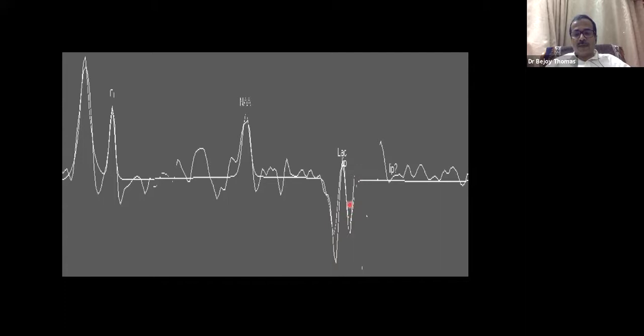For example, this is the 1.1 ppm 1,2-propanediol, which is actually there because you are loading with phenobarbital, and this is the lactate. Again, when you are using lactate as a prognostic measure for outcome, you should not misinterpret 1,2-propanediol as lactate.